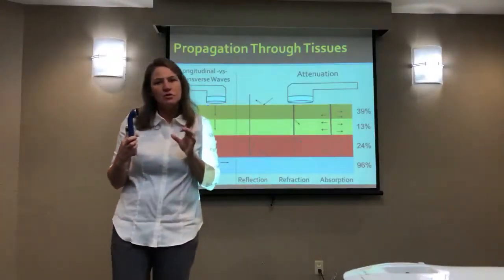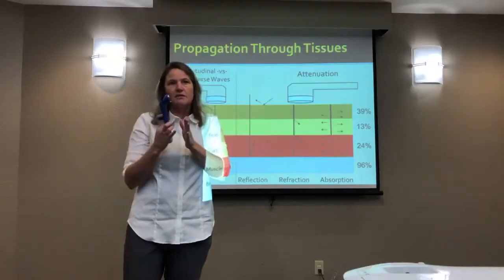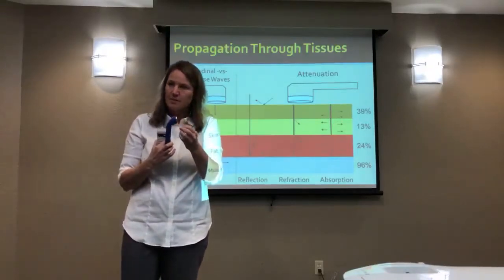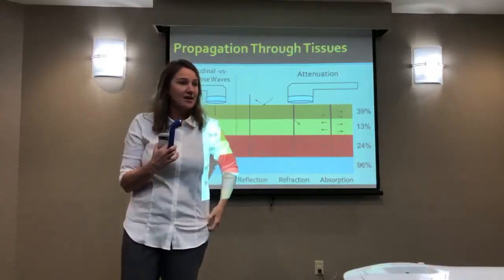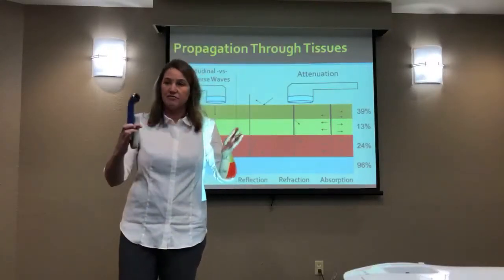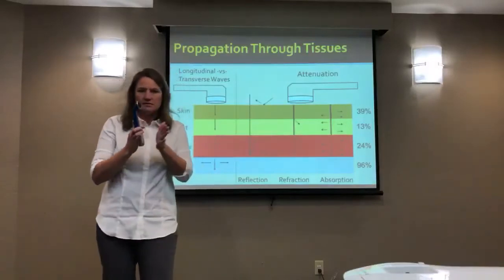So the idea with the ultrasound energy is the further it goes through your body, the more it becomes like a cone and it spreads a bit, and the less dense it becomes. So clearly, if you're treating a superficial target, the amount of energy that's capable of getting there is going to be more dense, it's a little bit less scattered. The deeper you go, the higher you're going to have to go on your intensity, because by the time you get there, it's going to have decreased by these different attenuation ideas. Okay, so that's the idea of refraction, and it spreads a bit.